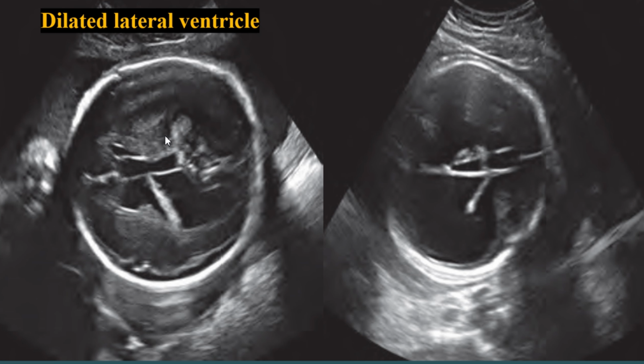And now here we can see the dilated lateral ventricles. This one is the dangling choroid plexus. This axial image of the fetal head demonstrates the anterior portion of the choroid plexus along the medial wall of the lateral ventricle, with the remainder of the choroid plexus dangling toward the lateral wall of the lateral ventricles.